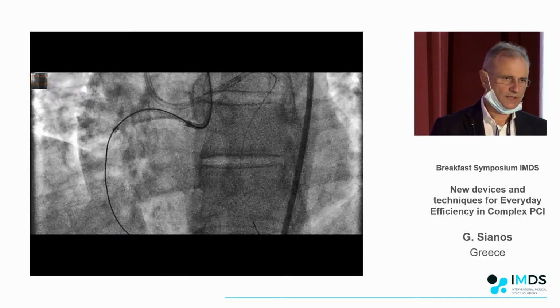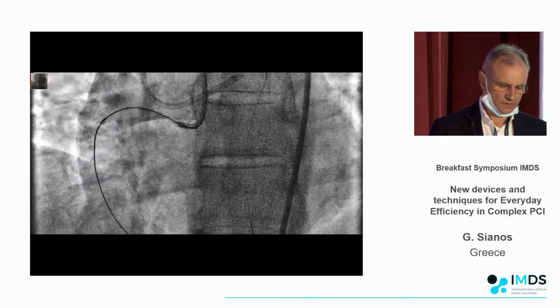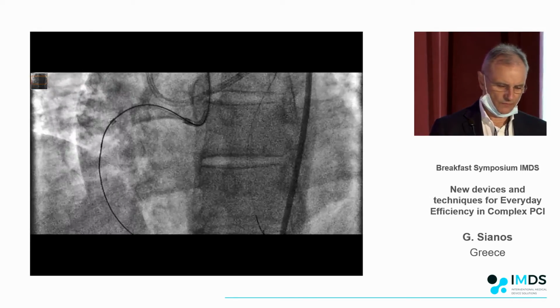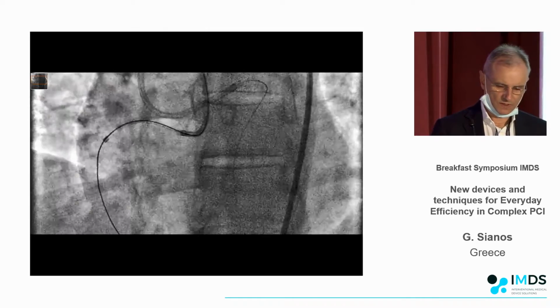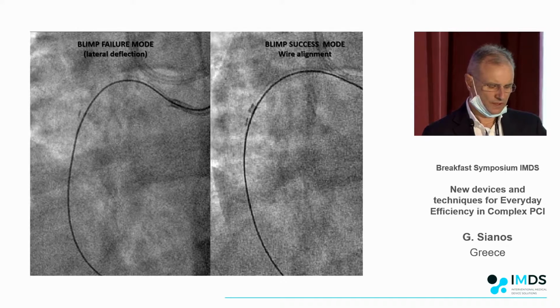It was one of the first cases. It's more than a year now that we started doing these cases, because I was one of the first ones to get the device in my hands. And then we were asking how is that really working? You see this stop frame, the marker on the balloon. When it's far away, the short monorail is just in front of it.